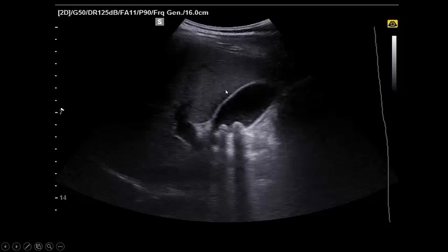You will see here the anterior border of the liver, here is the posterior, and there is the diaphragm, and you will see the gallbladder with hyperechoic wall and anechoic bile inside. In our patient, we saw very prominent gallbladder stones with shadow behind, and once you see this gallbladder stone, it is a biliary colic, but you need to explore two very important things.